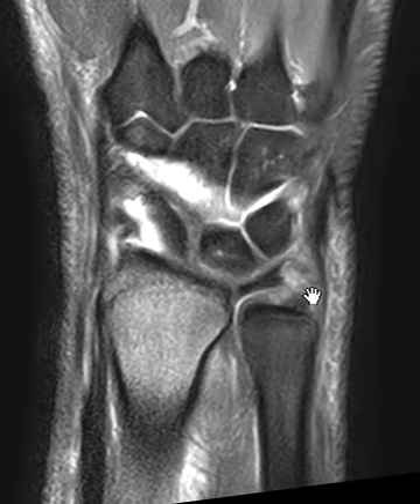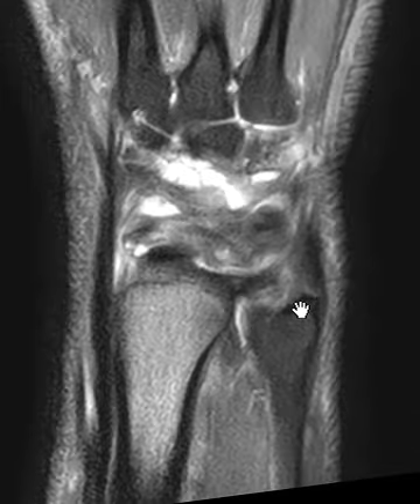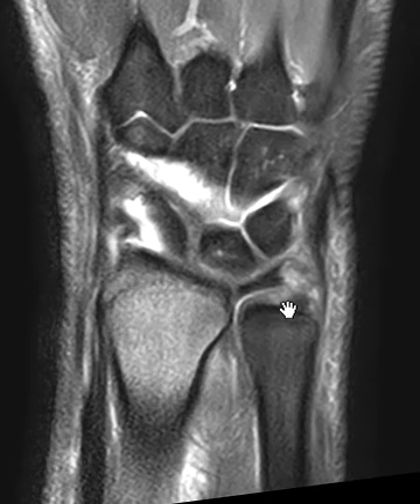This part should be attaching down here, so the TFCC has drifted distally. Another attachment should be down in a little groove — towards the radial aspect of the ulnar styloid — there's a little area right here called the fovea. So this TFCC should attach down here as well. The styloid and foveal attachments of the TFCC are torn here and here.